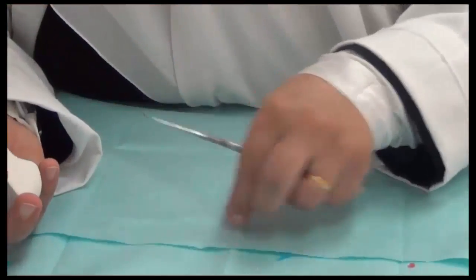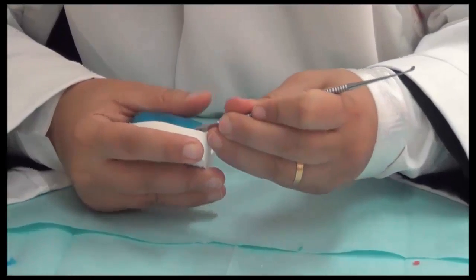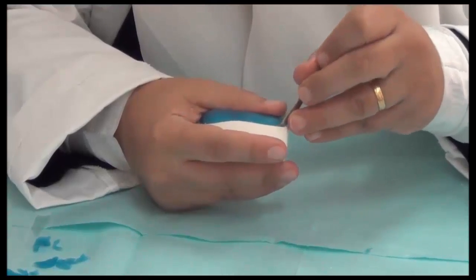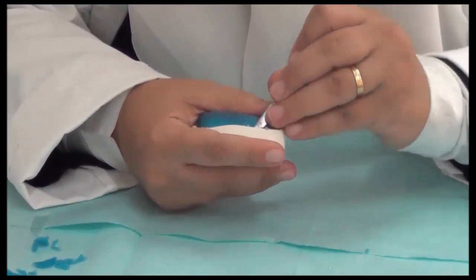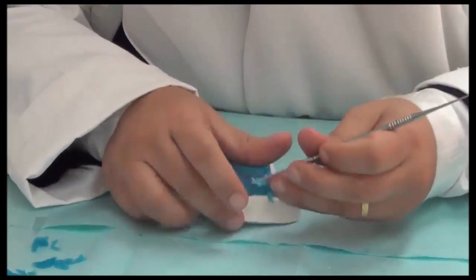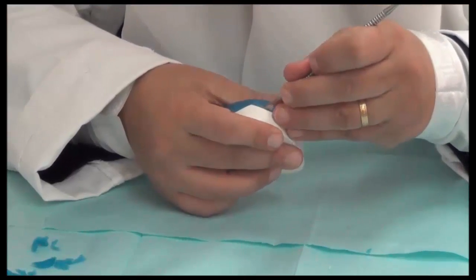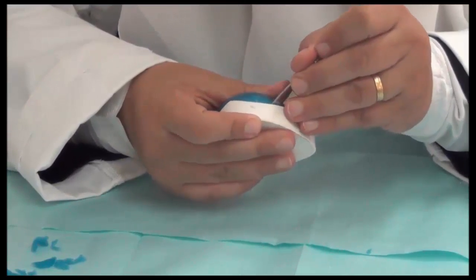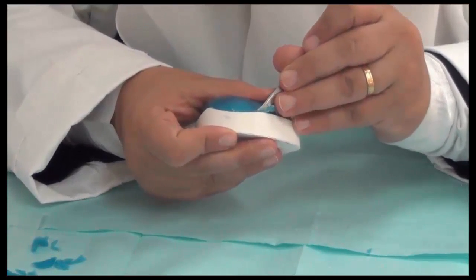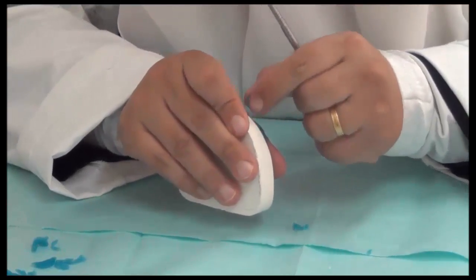You can see that we're taking our time because the material will stay soft and can be adapted all throughout the time until we light cure it. But that doesn't mean that you work with it for a long time, because the light from the room itself might initiate some reaction. So it's better to finish it off as soon as possible. So this is our tray material added.